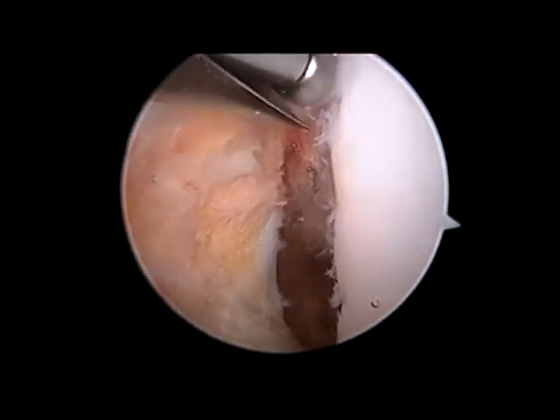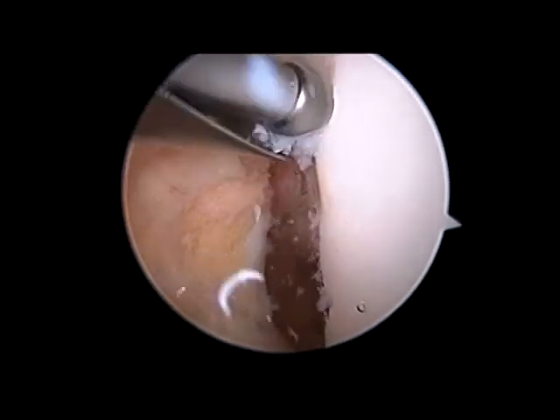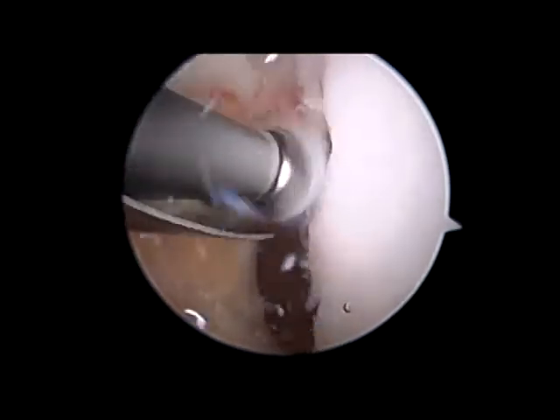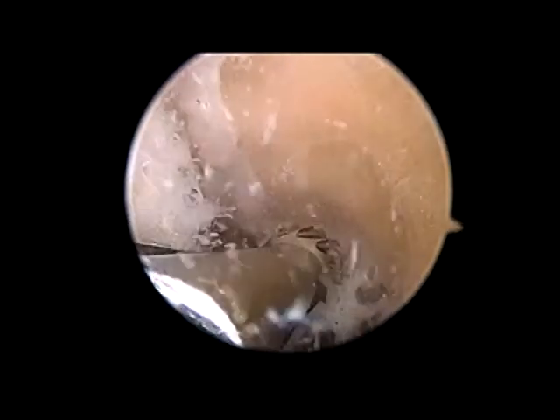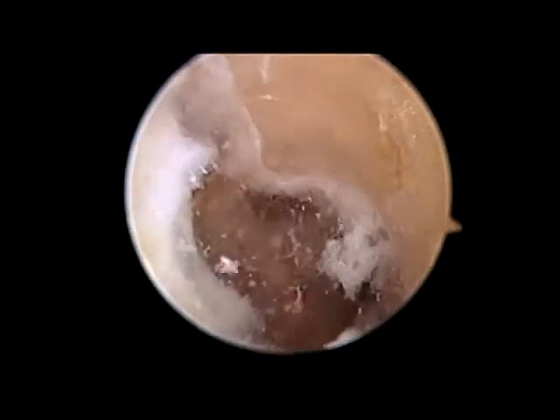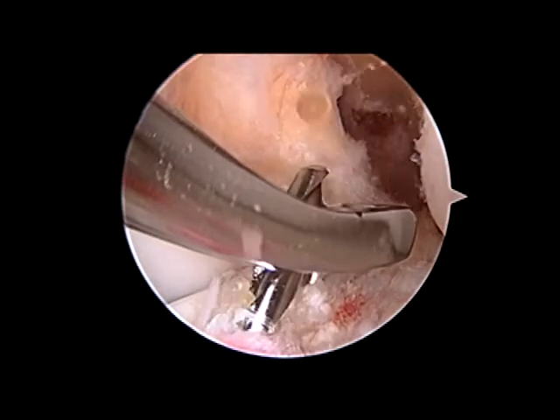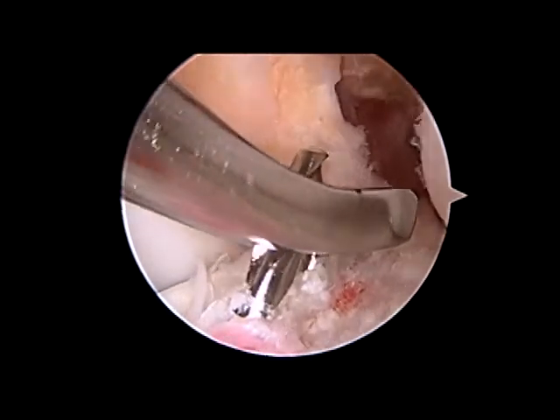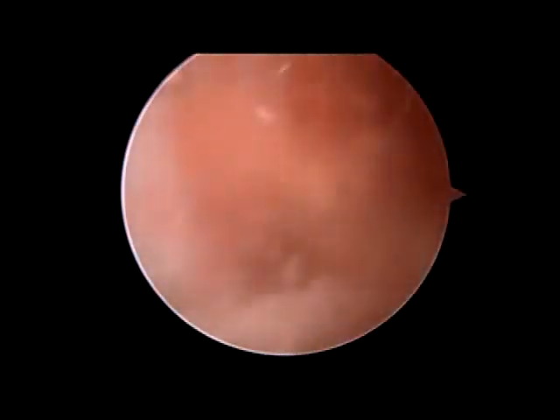After removing the soft tissue from that area, a burr is introduced to complete a notchplasty. A notchplasty is done by removing some of the side and top walls of the intercondylar notch to allow room for the new ACL graft. The burr is used all the way to the back wall to allow proper placement of the tunnels. A special guide is inserted into the knee and a guide wire is drilled through the tibia into the knee at the site of the previous ACL attachment.